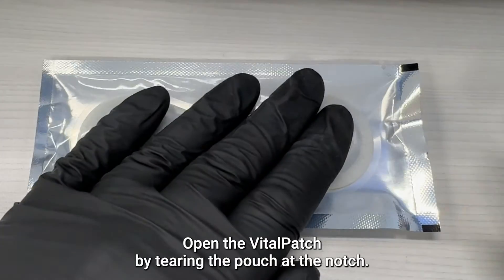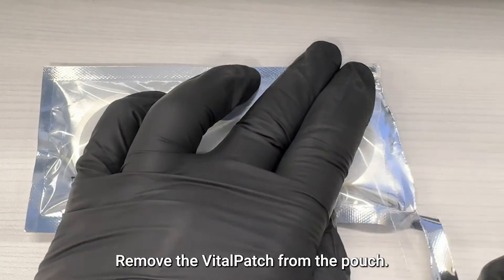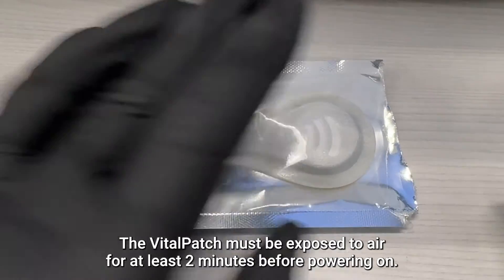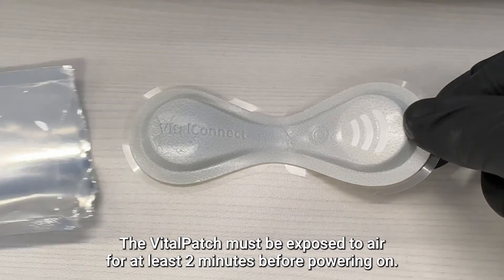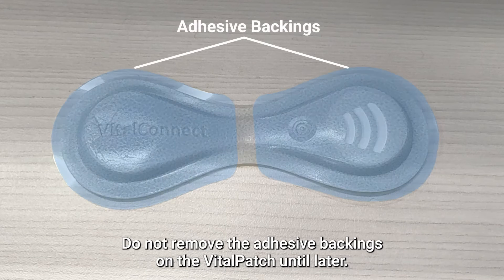Open the Vitalpatch by tearing the pouch at the notch and remove the Vitalpatch from the pouch. The Vitalpatch must be exposed to air for at least two minutes before powering on. During this period, you can prep the patient's chest. Do not remove the adhesive backings on the Vitalpatch until later.